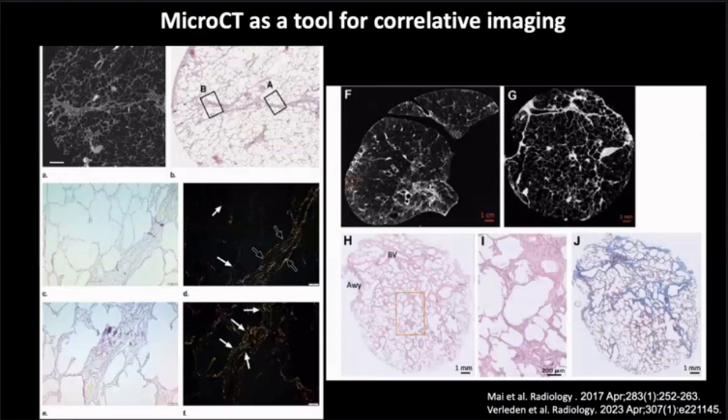So what is particularly interesting, of course, is that we see things on the CT that look healthy, but in fact are diseased on histology. So this is a little bit the goal, the holy grail, because this is the early stage of disease. Things you cannot see on the CT yet, but on the biological level, you already see the changes inside the tissue, which is illustrated here with fibrosis patterns. I will not go into detail because it's probably a little bit too far for this audience. But the basic principle is things you cannot see on CT, but are changed on the histological level.